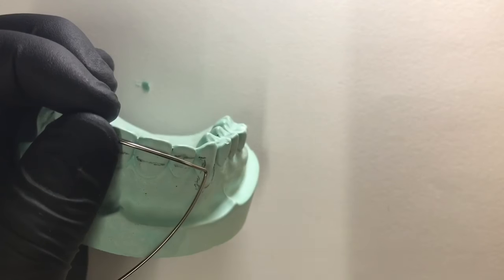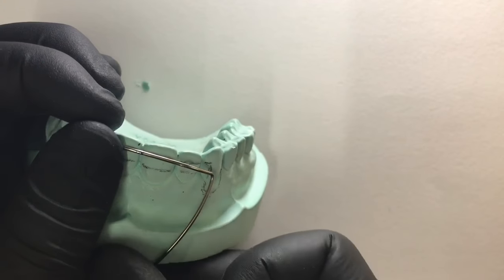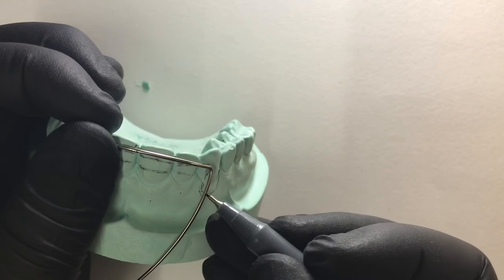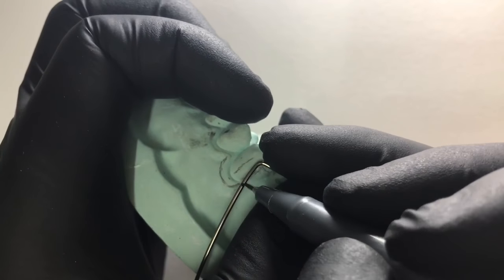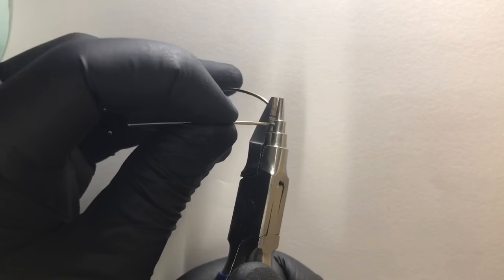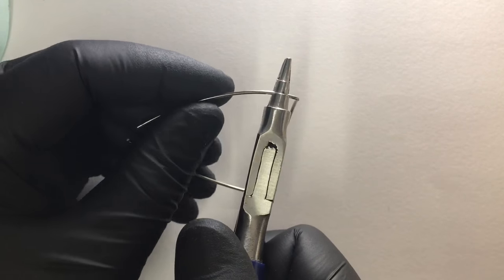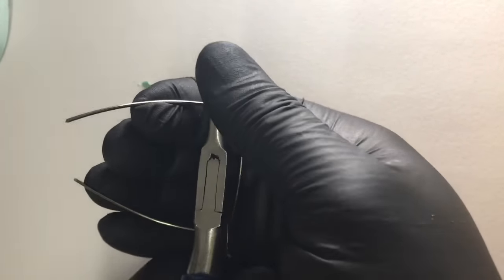This will help us in fabrication of the U-loops. Remember to keep the reference — the central point — in between the two central incisors. Now we mark the extension of the U-loops on both sides. Engaging at the groove of the universal plier, at the middle circular part where we would be forming the U-loops, we give a bend towards us in one complete go.